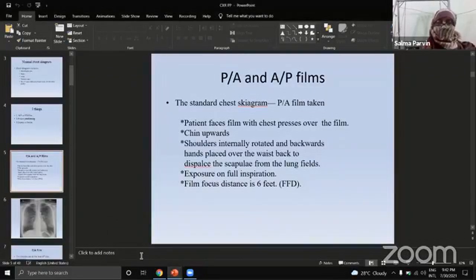The standard chest X-ray is very, very important for us to understand this 50%, to understand line A, line B, and line C, and what the standard is, and how far substandard we are dealing with. You will come to understand why it is necessary to know at the end of this session.